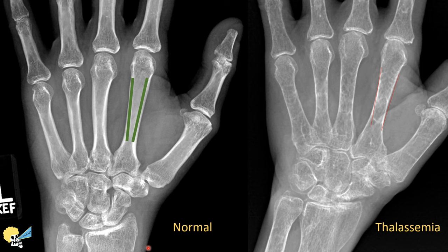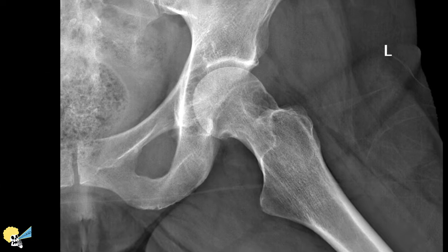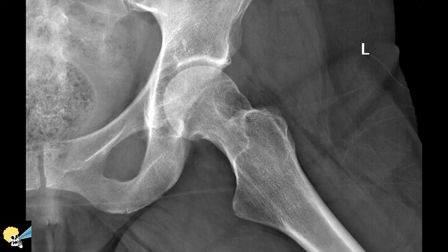So, one last case. Here is another young patient with apparent thickened trabeculae within the left femoral neck as compared to the right. In fact, what we have here is an intraosseous lesion of the left femoral neck, which displaces the normal trabeculae, as we can clearly see on the lateral view.